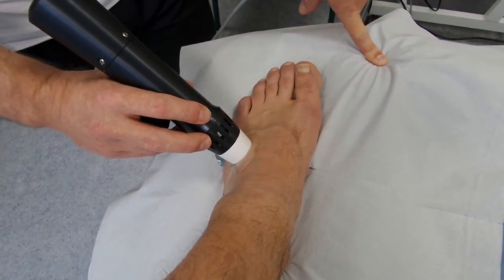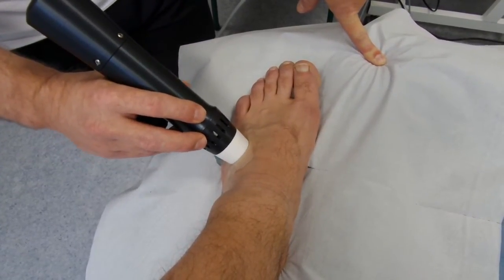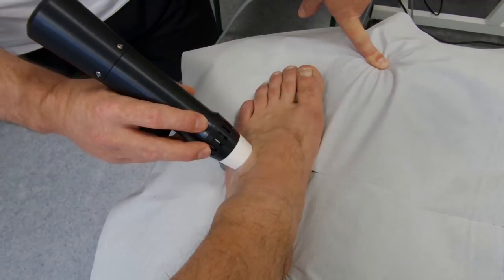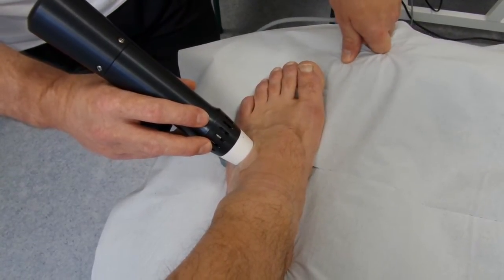As you can see here, we move around and pick up a bit of gel. We find the resonant area — it's not too difficult in between the two metatarsals in this case — and we're targeting the bursa to see if we can reduce it.